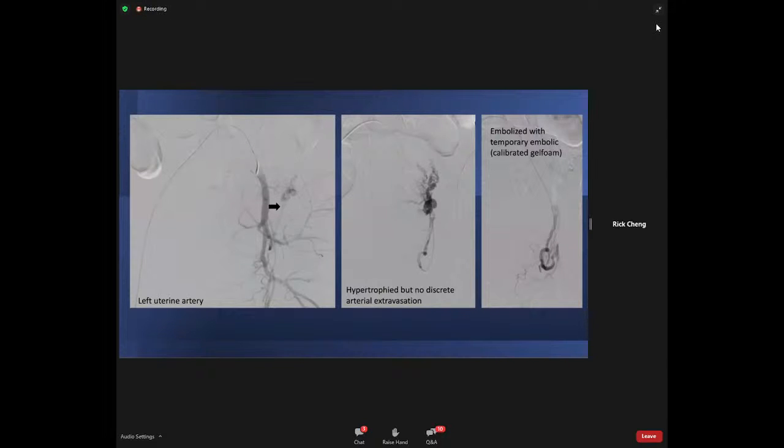Also, it is important to keep in mind that time is often of the essence when it comes to postpartum hemorrhage embolization. So deep cannulation of the uterine arteries is not always necessary and may not always be possible, just because vessels can be very clamped down. Gelfoam embolization can then be performed via the anterior division of the internal iliac artery to just allow for quick hemostasis.